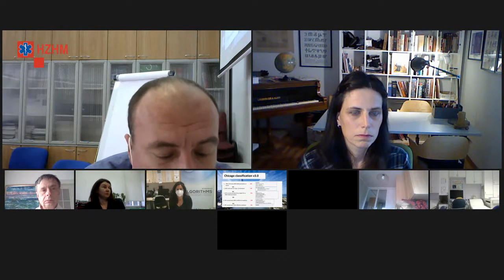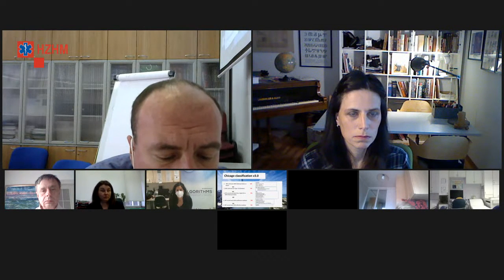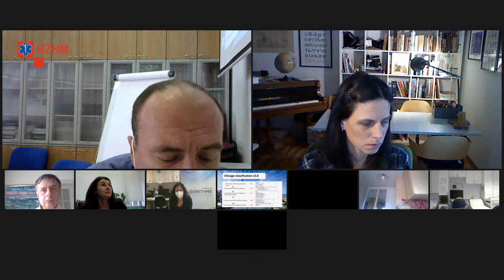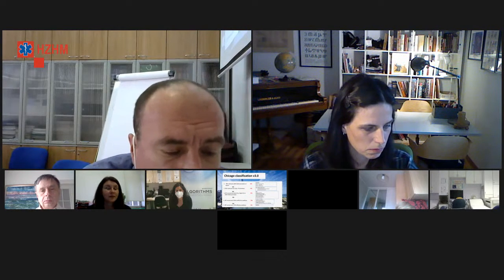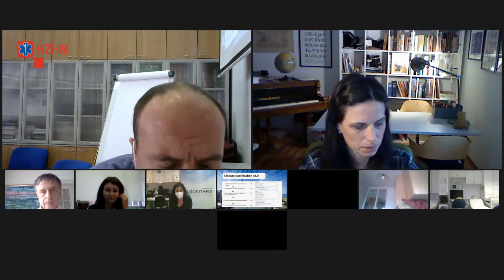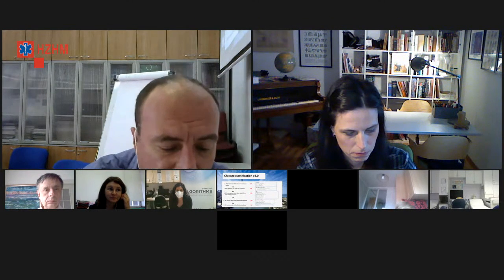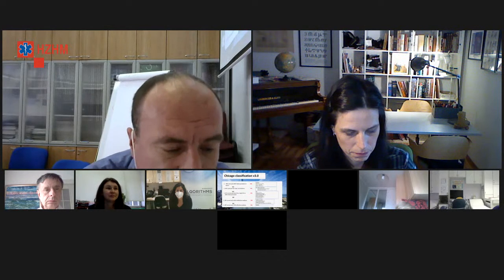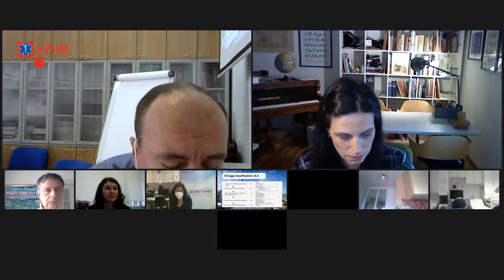Do ove faze s koronom, koja nam je malo izmijenila situaciju, prosječno smo imali otprilike 1 do 2 pacijenta za gornju manometriju tjedno. To se dosta smanjilo zbog posebnog epidemiološkog stanja i nedostatka osoblja, tako da sada imamo otprilike 3-4 pacijenta mjesečno.